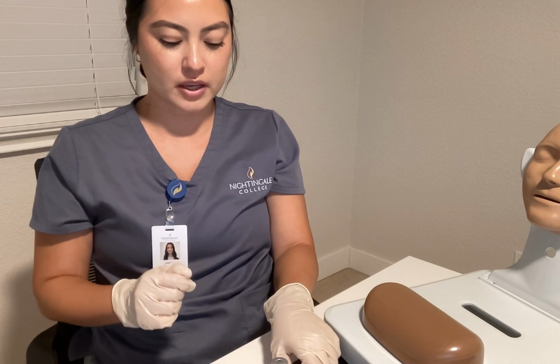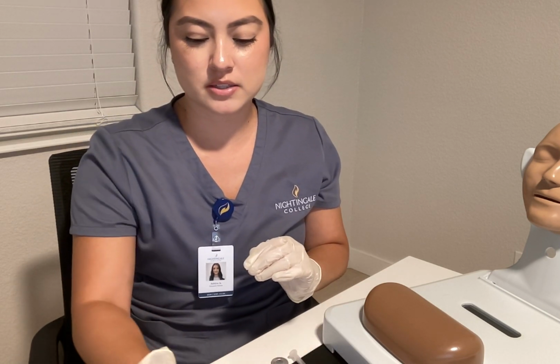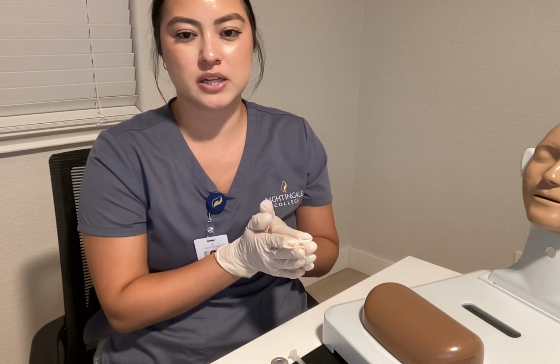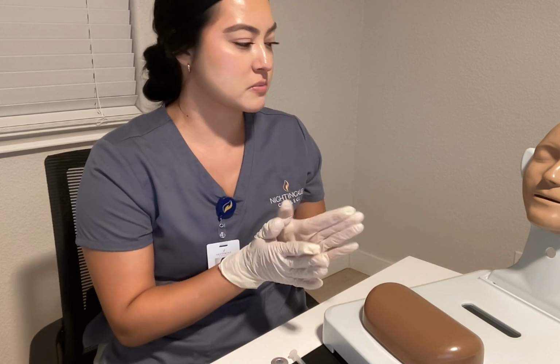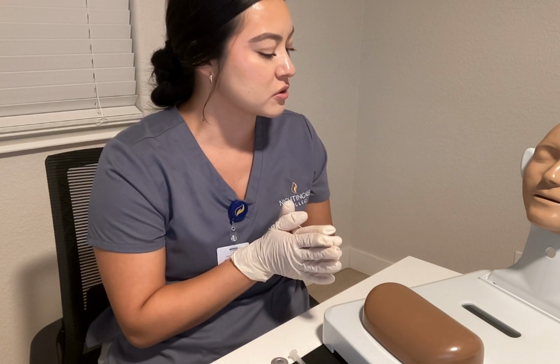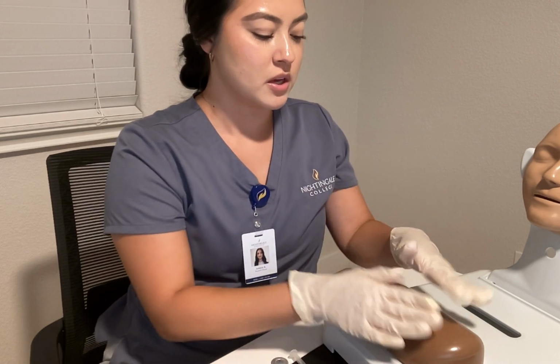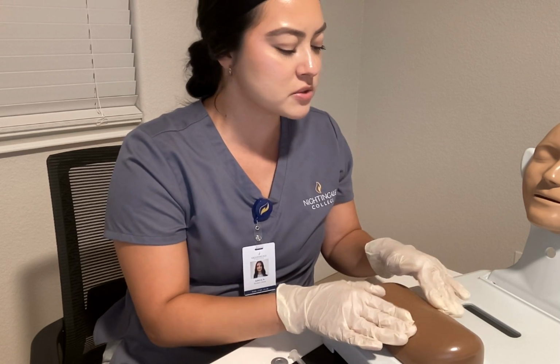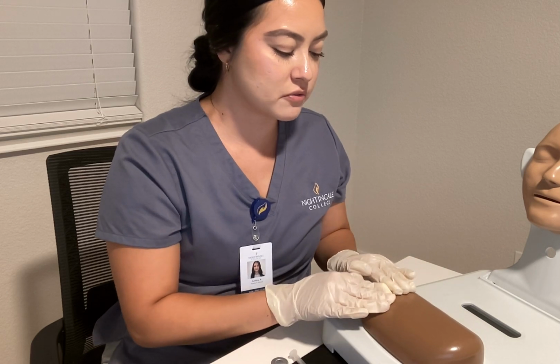Now that we have our medication drawn up, we're going to verify the site that we will be injecting. Today we're going to be injecting into the ventrogluteal site. So Mr. Smith, we're going to inject this into your glute area. I'm going to expose the area if that's okay. Okay, perfect. I'm going to take a look at your skin, make sure there's no bruising, no tenderness when I'm touching you here. Okay, perfect. And I don't feel any lumps.